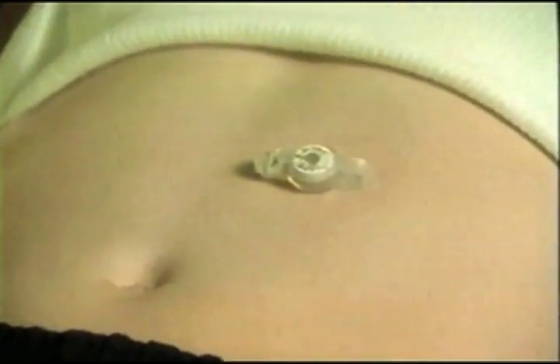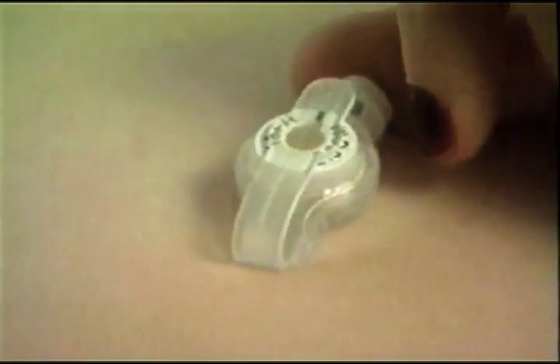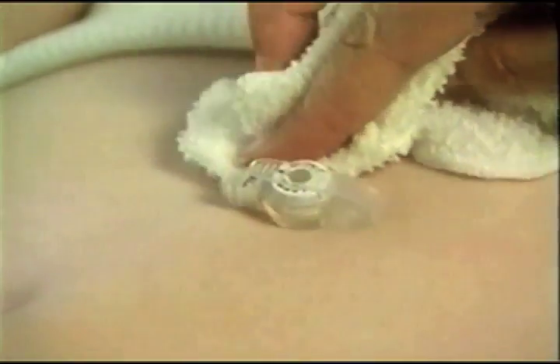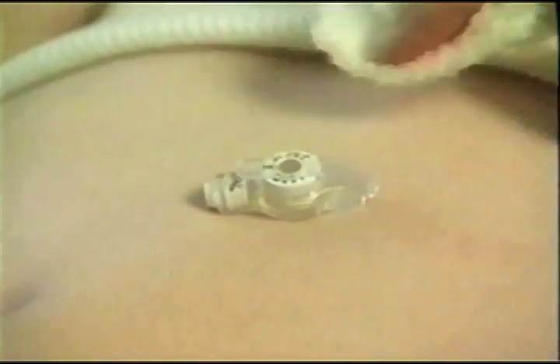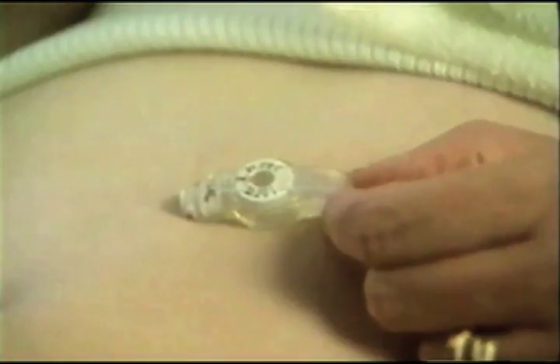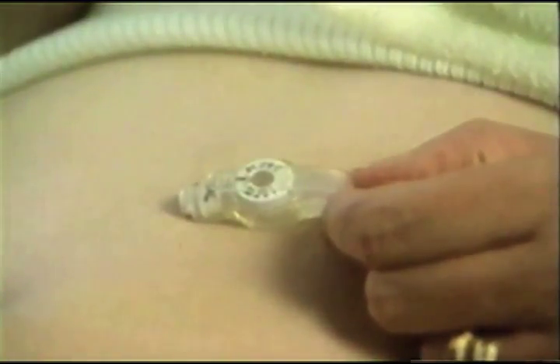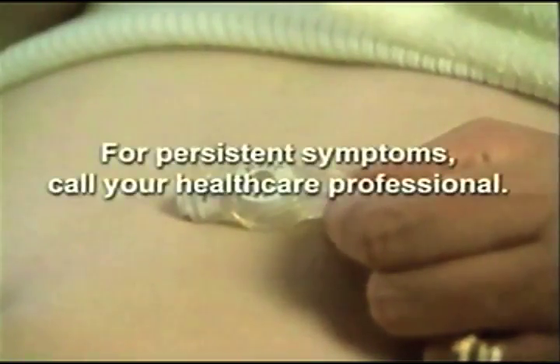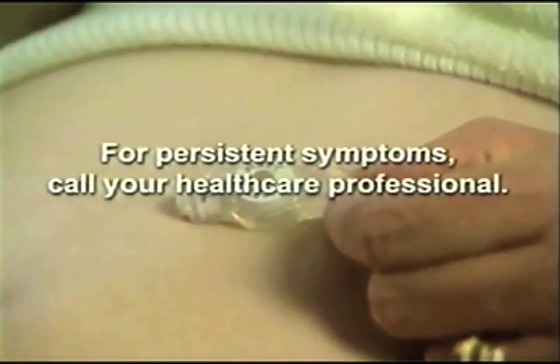Keeping the stoma site clean is very important, but it is also very simple, with just a few daily steps. Each day, rotate the tube within the tract to prevent adhesions. Clean around the stoma with mild soap and water and pat dry. Your doctor or caregiver may recommend other cleansing agents as well. Be sure to check the stoma site daily for any signs of redness, leakage, infection, swelling, or bleeding from within and around the tube. If you find such symptoms and they appear persistent, call your healthcare professional.